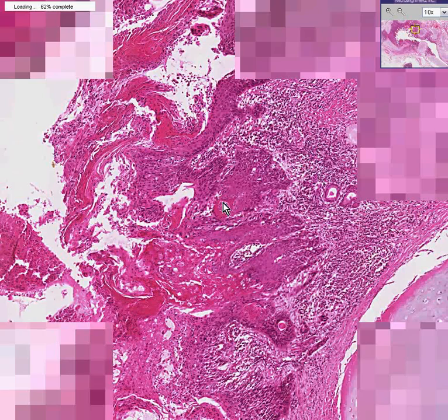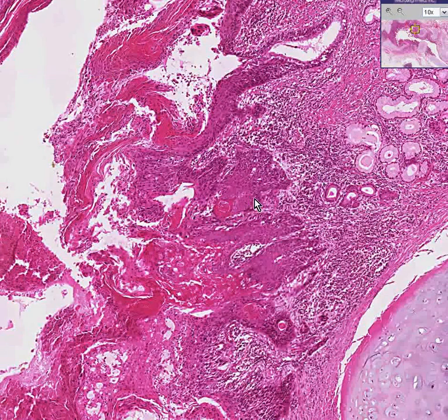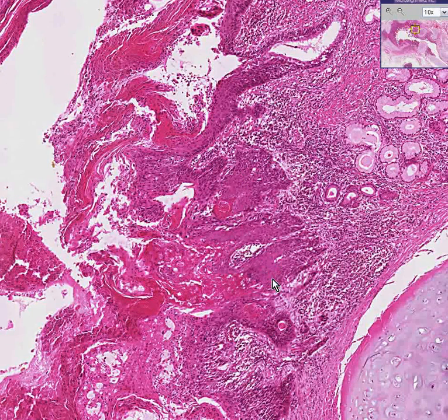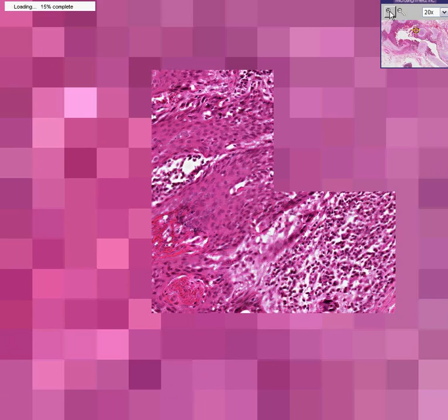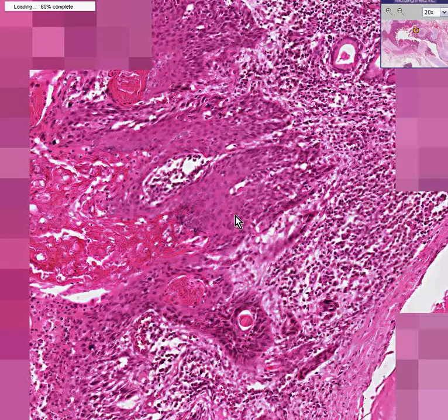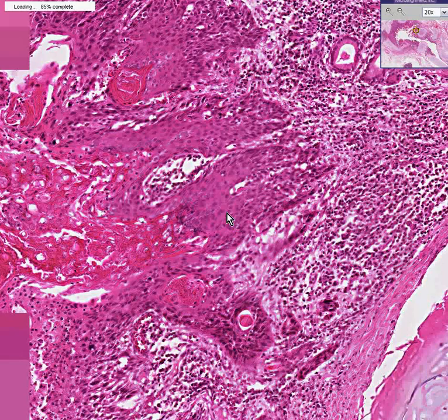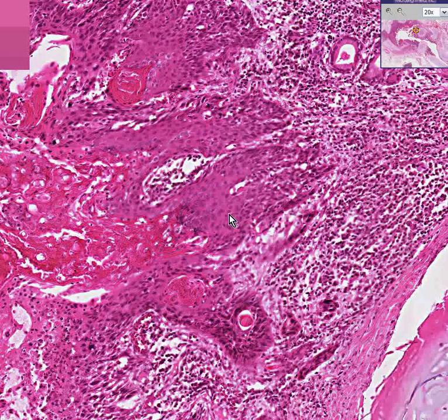However, if this pearl was not present and all you had were tumor nests like this, and you happened to see intercellular bridges between the infiltrating squamous tumor cells, then you could call this a moderately differentiated squamous cell carcinoma.